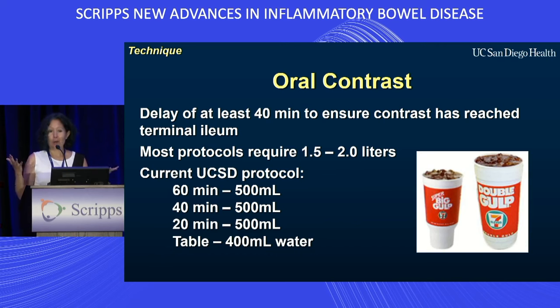I think this can be somewhat overwhelming, but there's people out there that drink a double gulp of Coke in the morning. So if you want to put it in that sort of context, it's a lot of fluid, but we want to engage the patient from the moment that you tell them they're going to be getting this examination to the moment they're coming to our waiting area, and let them know this is a team effort.